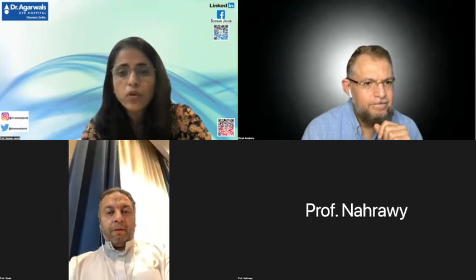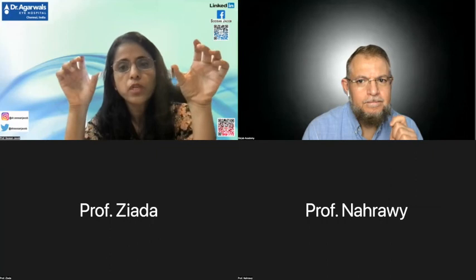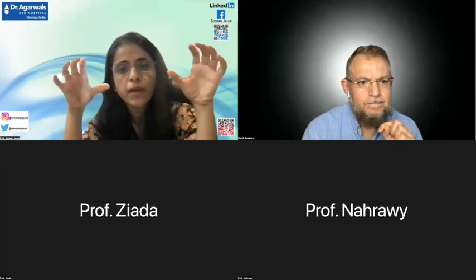Yes, I use a slightly different approach with PMD. But right before that, I'd like to state that I have not done too many cases of PMD because obviously the condition is much rarer than keratoconus. So I have done some patients, and I use a slightly different approach where I basically put two thinner and shorter segments on the steep axis just to lift it up, and we've got good results.